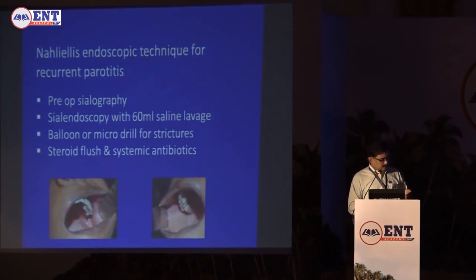So, this alone I will not suggest you to do. This is Naheli, an Israeli dentist. He had been to our hospital for running a workshop 2 years back, and he has his own excellent techniques. Like he can take out the front stricture of a submandibular duct, pull the rest of the duct and suture it intraoral. So the stricture part is totally removed, and the rest of the duct becomes the actual duct draining into the mouth.